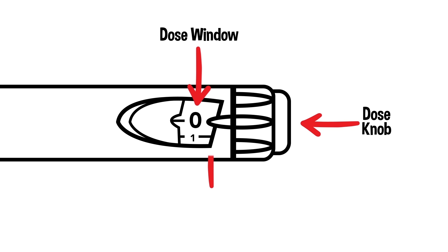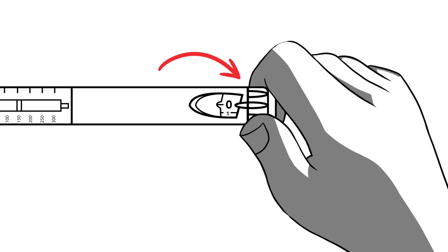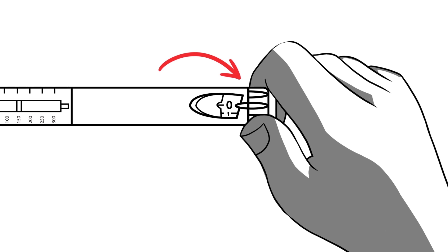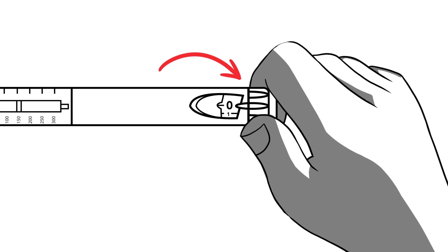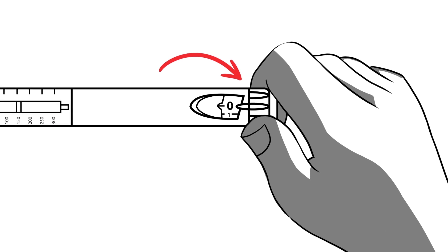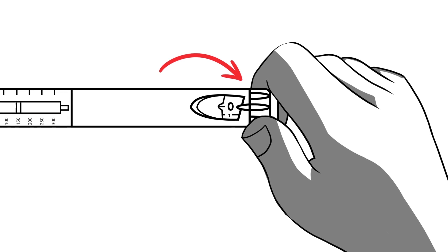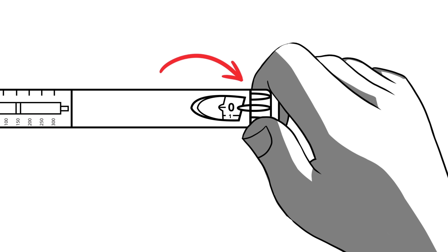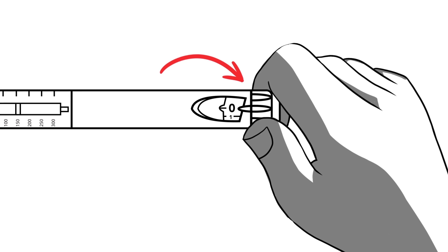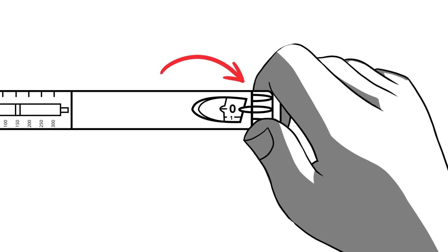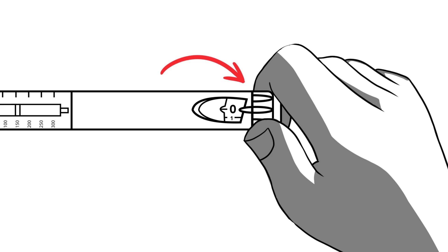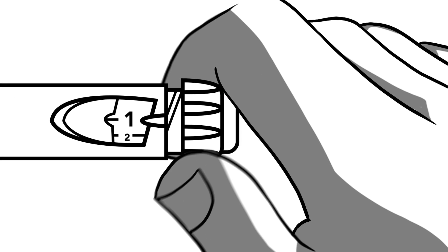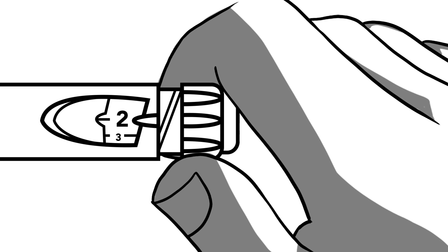The small arrow next to the window, the dose indicator, will be pointing to zero. By turning the knob next to the window clockwise, you can select your dose. We will first be testing the pen with a test shot of two. This is also called priming the pen. This process will remove any air bubbles that would block the full injection dose. Let's dial the knob until the dose indicator says two.